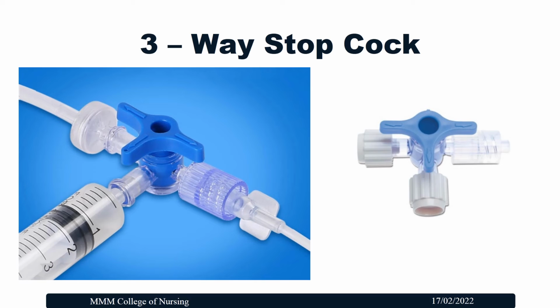Three-way stopcock is a sterile device which is connected between the IV tubing and the IV cannula, facilitating the administration of injection during the IV infusion. Here we can see the arrow mark, with 3 different angles. When we are giving the medication, the medication can flow only in the direction the arrow indicates. When we want to administer along with the IV fluid, the same position can be maintained. But when it is turned to the right angle, only the medicine from the syringe will flow inside. After the injection, the lock can be turned again to resume the IV infusion.